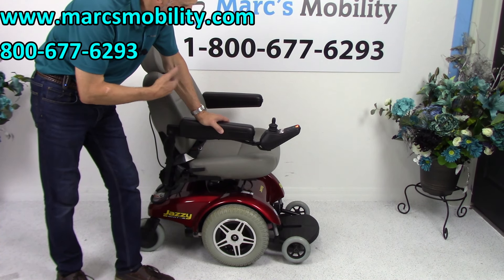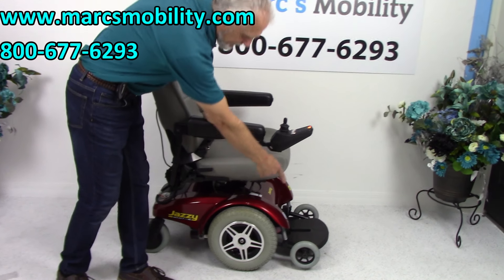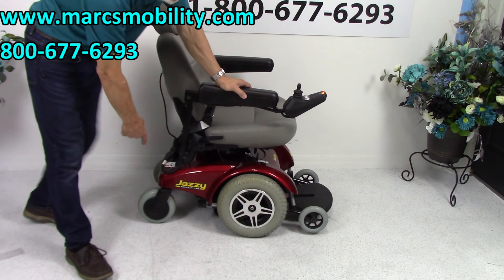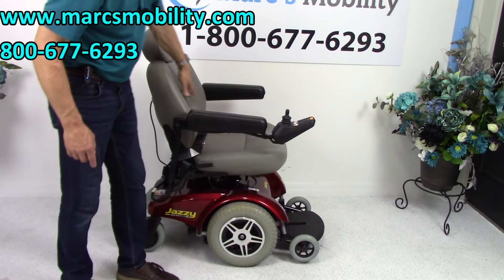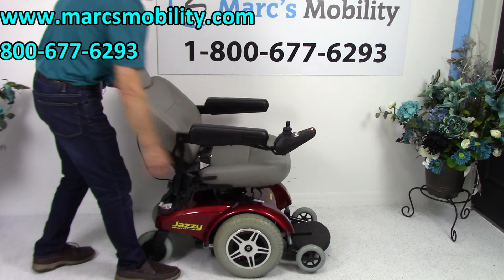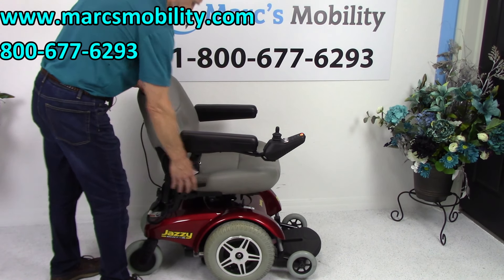There's not a whole lot that goes wrong with these types of power chairs. There are 14-inch solid tires here, tip wheels in the front, and eight-inch caster wheels in the back. This is a captain seat, so what that means is you have a lever — you can fold the seat down or go all the way back. This is as far as it will go. This is an adjustable captain seat.